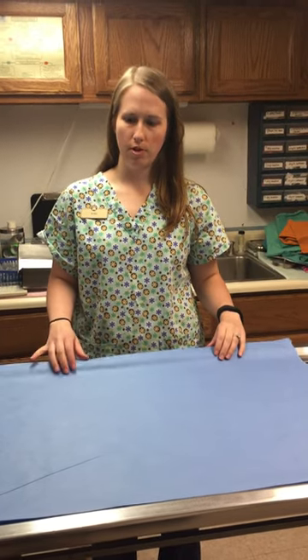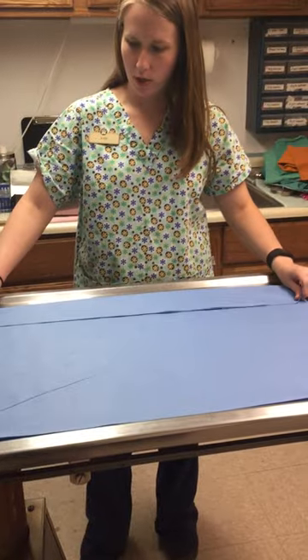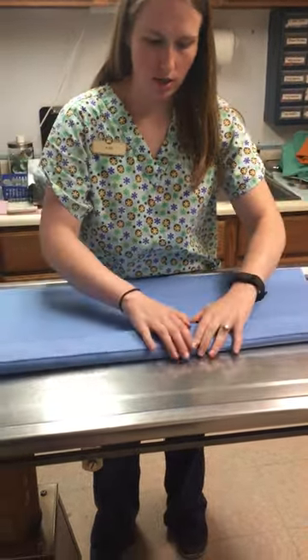Skill sheet number two — I'm going to be folding and wrapping a drape. So the first thing I'm going to do is accordion style fold the drape lengthwise like this.